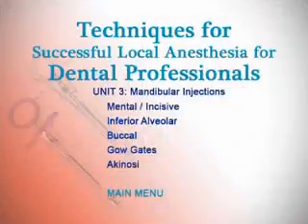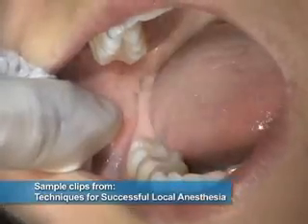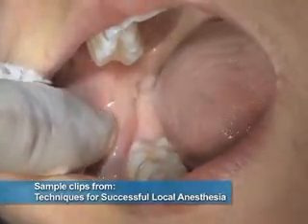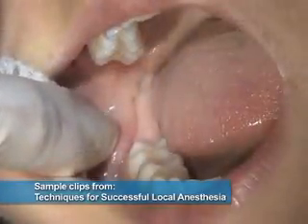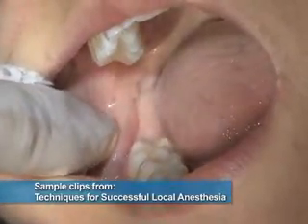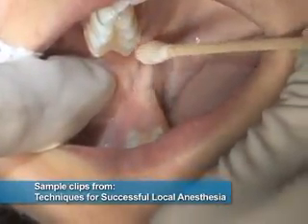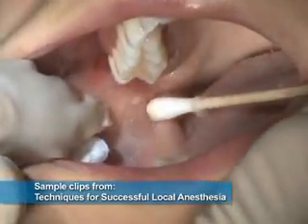Mandibular injections, Unit 3. The inferior alveolar and lingual injections. Gently retract the cheek laterally. Palpate landmarks. Locate and palpate the internal and external oblique ridges, coronoid notch, and pterygomandibular raphe. Dry the tissue with a 2x2 prior to placing the topical.